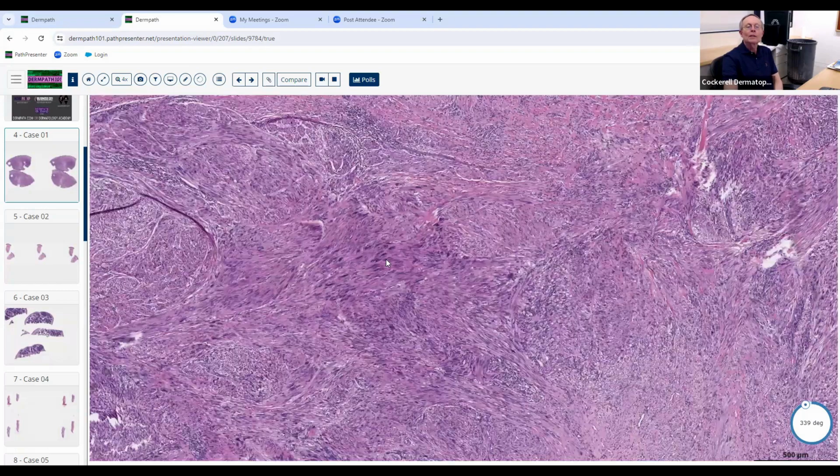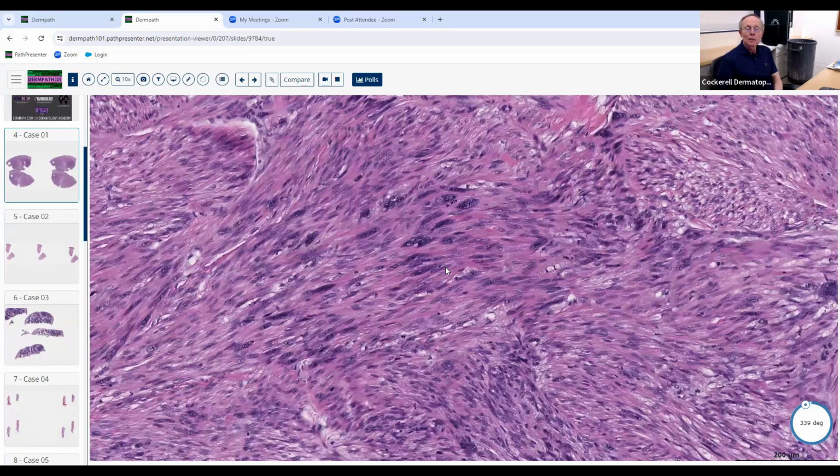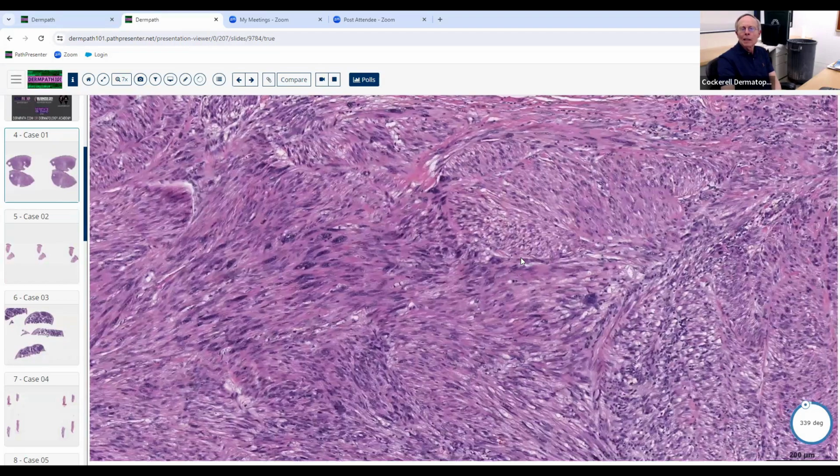As you go to higher magnification, we do see that it is spindle in nature. And we look at the cells and see if they look blunt, like cigars in a way. Those are more characteristic of muscle lesions. A couple other things can help you if you're dealing with a muscle lesion. If you see these large fascicles that look like they're cut both vertically and horizontally, in cross section as well as longitudinally, that's far more common with muscle, in my experience.